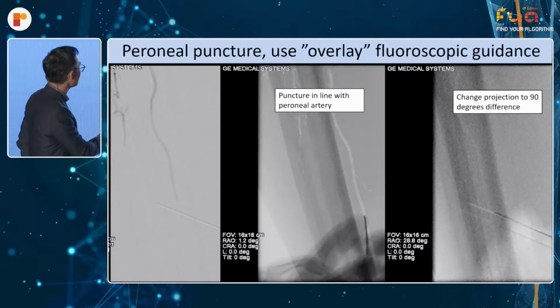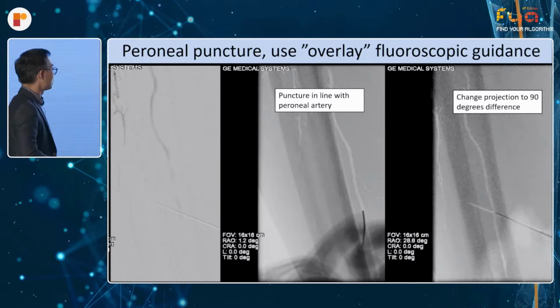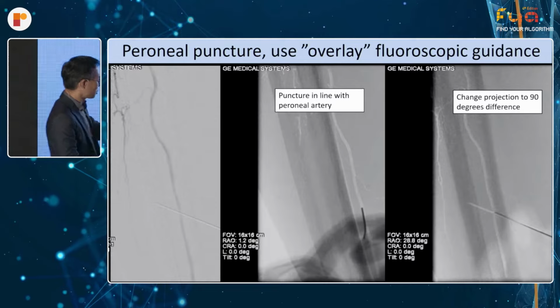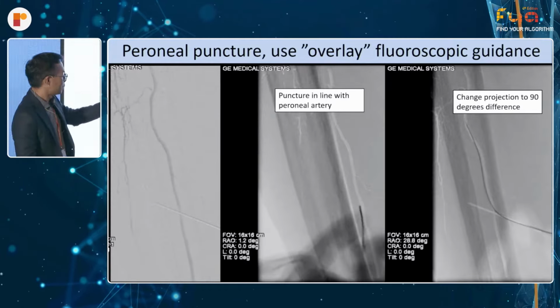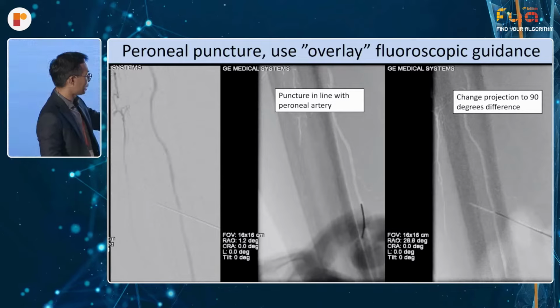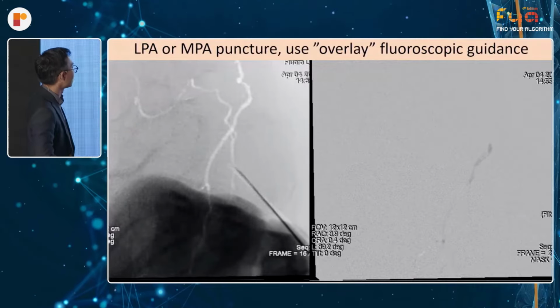Fantastic technique. For peroneal artery, almost always I use the overlay fluoroscopic guidance. So puncture in line with the peroneal artery, and I normally go past it. Once I've gone past it, as you can see in the last diagram there, I will then change the projection to at least 90 degrees difference, and I will pull it back until I'm inside the peroneal artery, and from there you can then track your retrograde wire through.